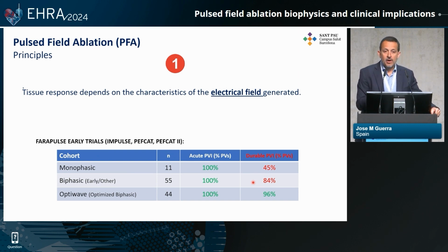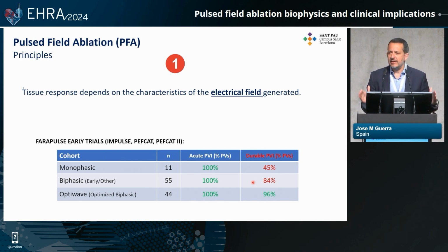And this is because you have irreversible electroporation, and you have reversible electroporation. Your lesion comes back. So the cell, at one point, doesn't work when you apply the energy, but later on, the cells recover. So you have to adapt and optimize your waveform in order to create the effect you want to get. So this is limiting, but it's also extremely important, critical at the time of designing a PFA protocol, at the time of applying PFA. Each energy behaves a different way.